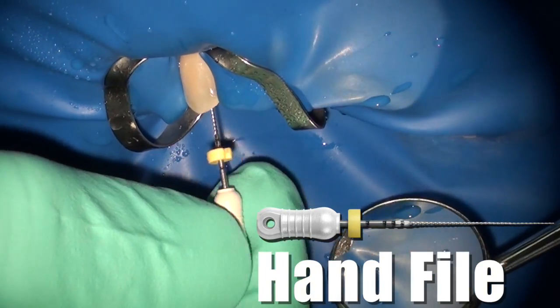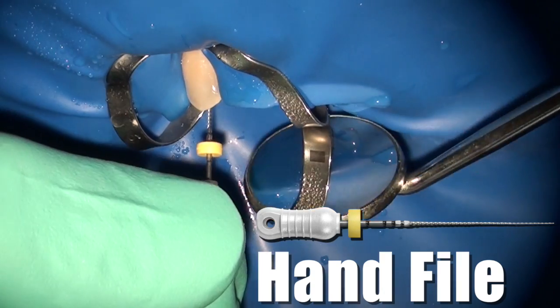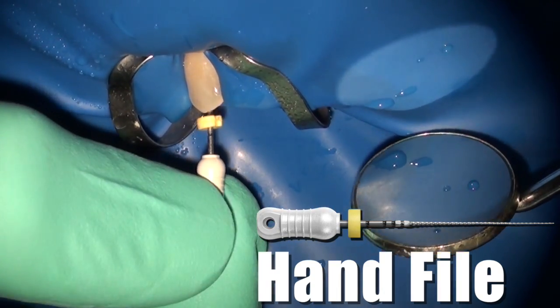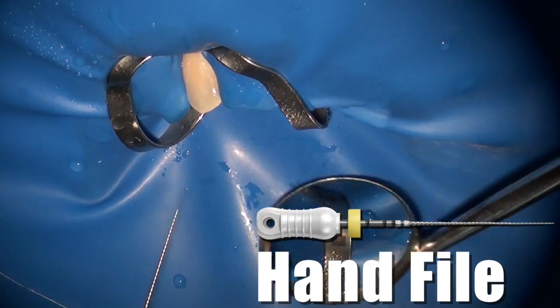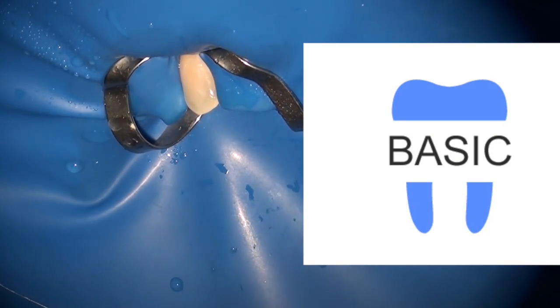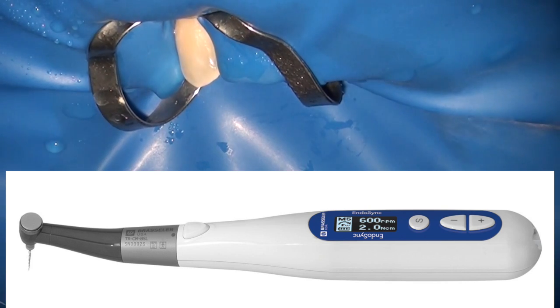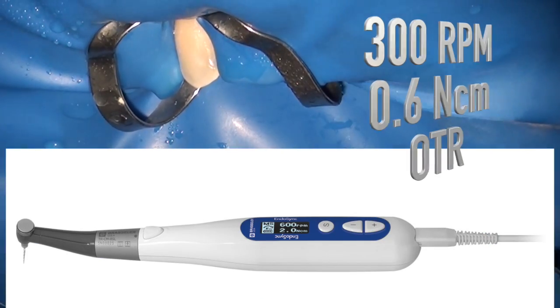Now we're ready for our first instrument inside the tooth. We use a size 15 hand file to triage the case and determine whether we're dealing with a basic or advanced canal. Of course, we know this is going to be a basic case.